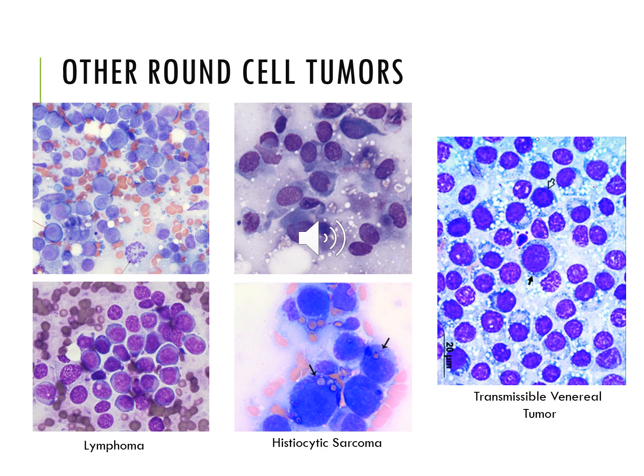The image below for the lymphoma pictures, so that's what a lymphoma aspirate stained with Diffquick looks like, and you can tell that it's just a lot harder to see a lot of the cellular detail when it's stained with Diffquick, and so it can be really hard in practice to make the diagnosis of lymphoma when you can't fully see all the criteria of malignancy that are present.